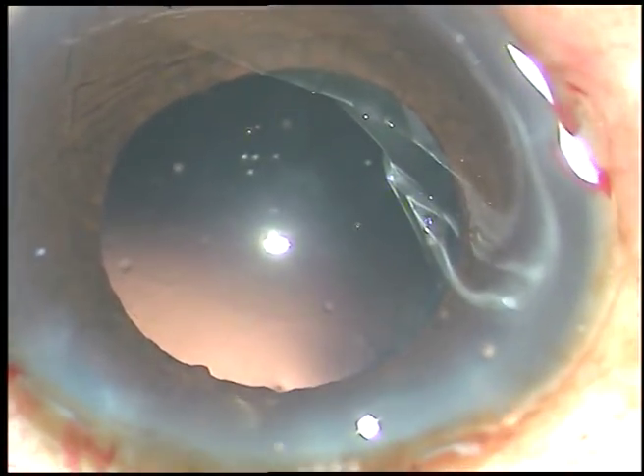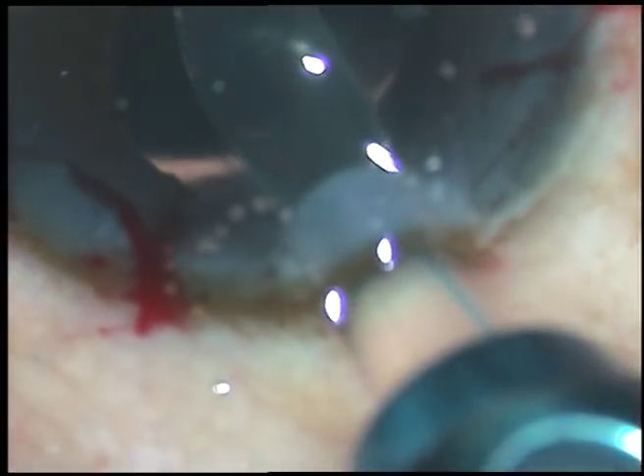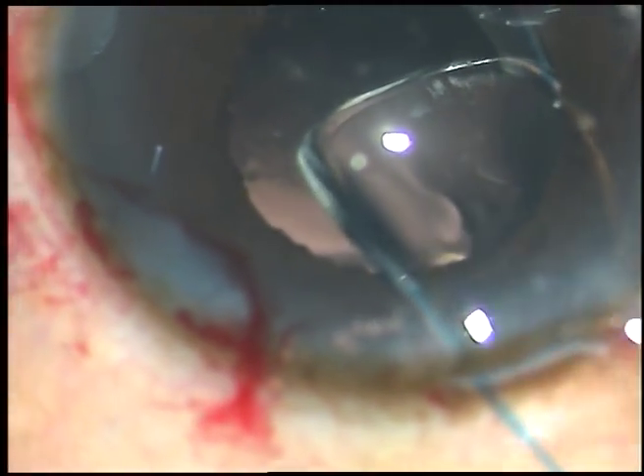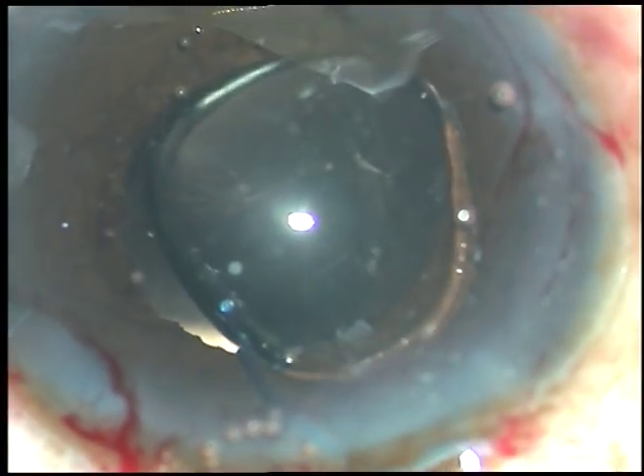And now viscoelastic substance is injected. In this case I have selected a multipiece intraocular lens — this is a Sensar multipiece intraocular lens from Abbott. No financial interest, but this is a very good lens. I have enlarged the incision a little bit, and now I am going to implant the lens in the capsular bag. The leading haptic has gone into the capsular bag; then the trailing haptic is held with McPherson's forceps and placed in the capsular bag.